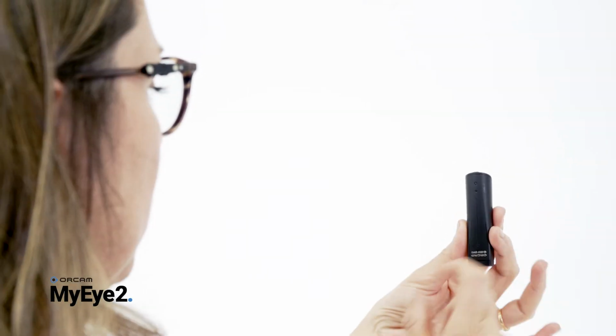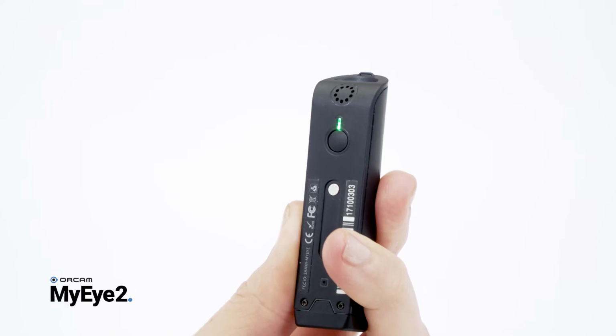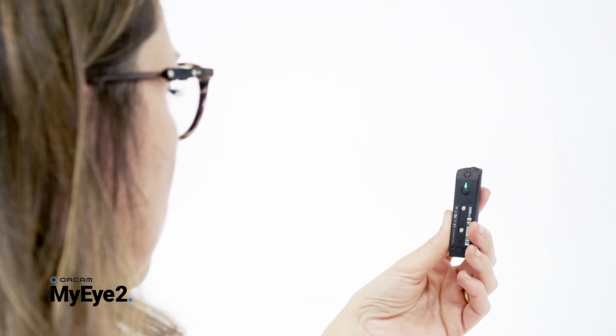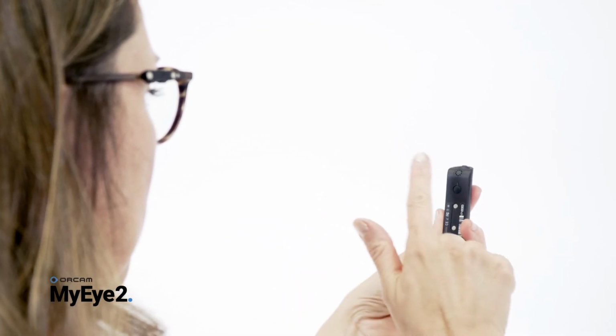To power on the device, press the round button on the inner side of the device for a few seconds, until the LED light next to it turns green. You will then hear beeping sounds, followed by "OrCam version 8 is ready. Battery is 100% charged."